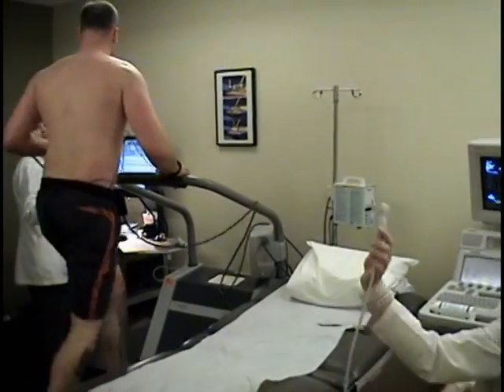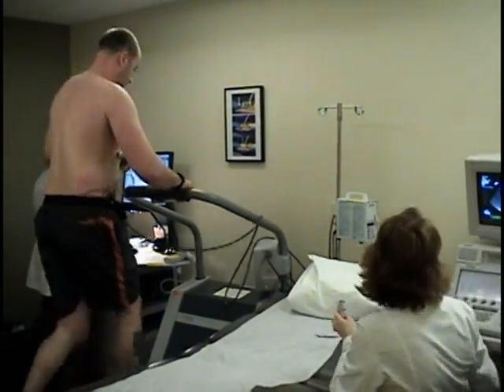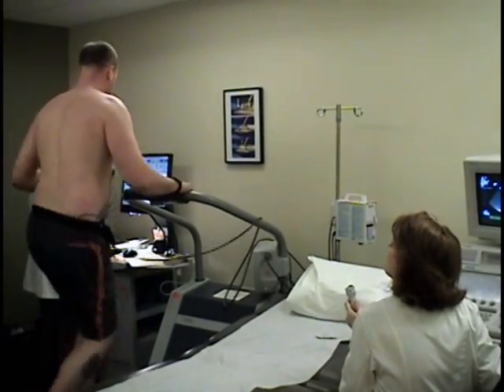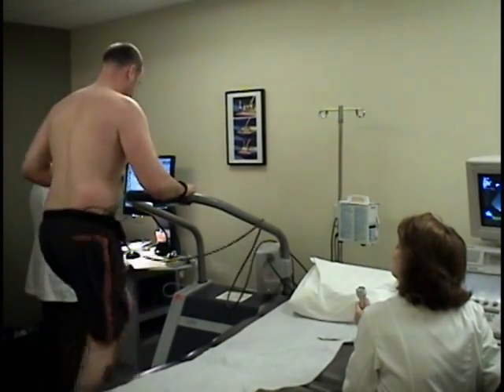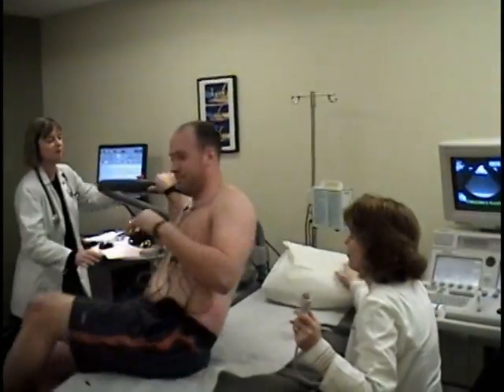Once you reach your target heart rate, it is very important that you lie down on the echo bed immediately. Our sonographer only has approximately 30 seconds to capture the images of your heart while it is beating at its peak rate.